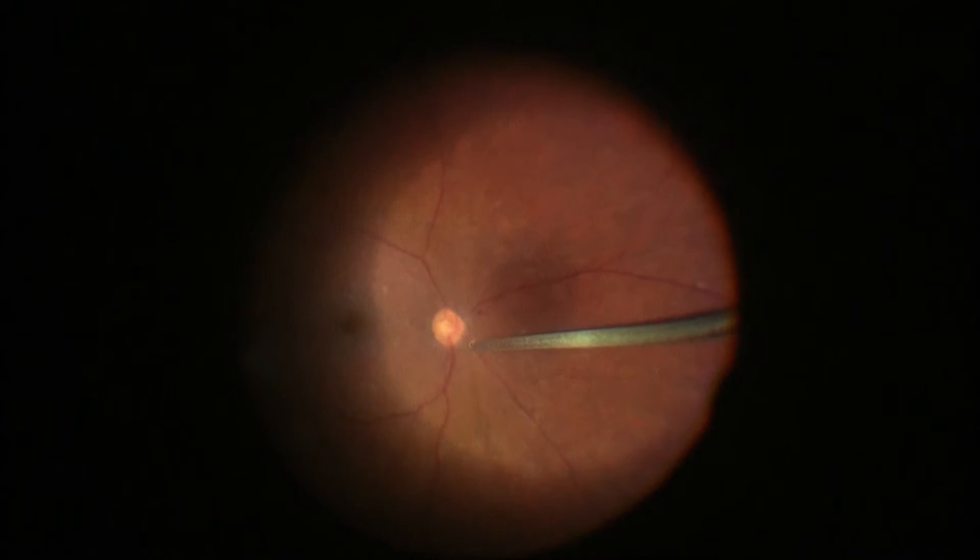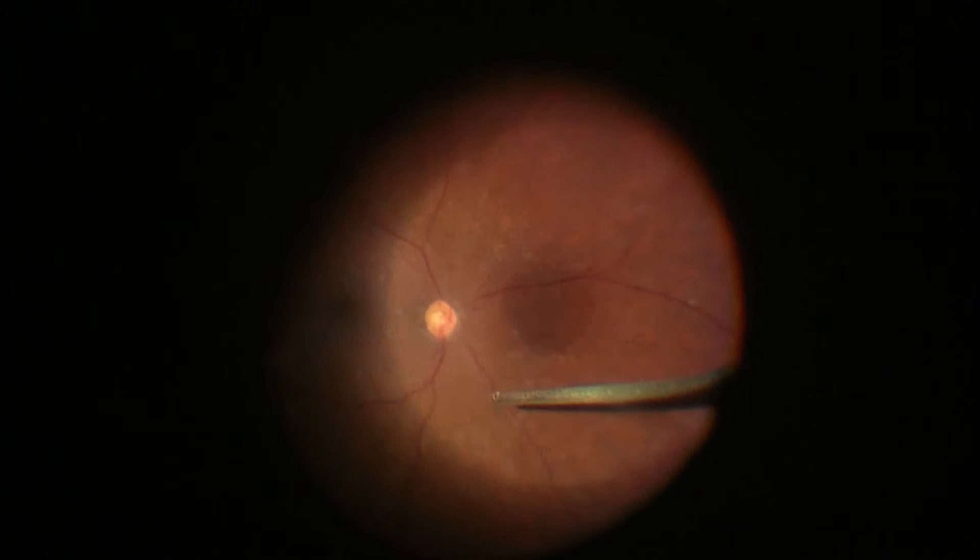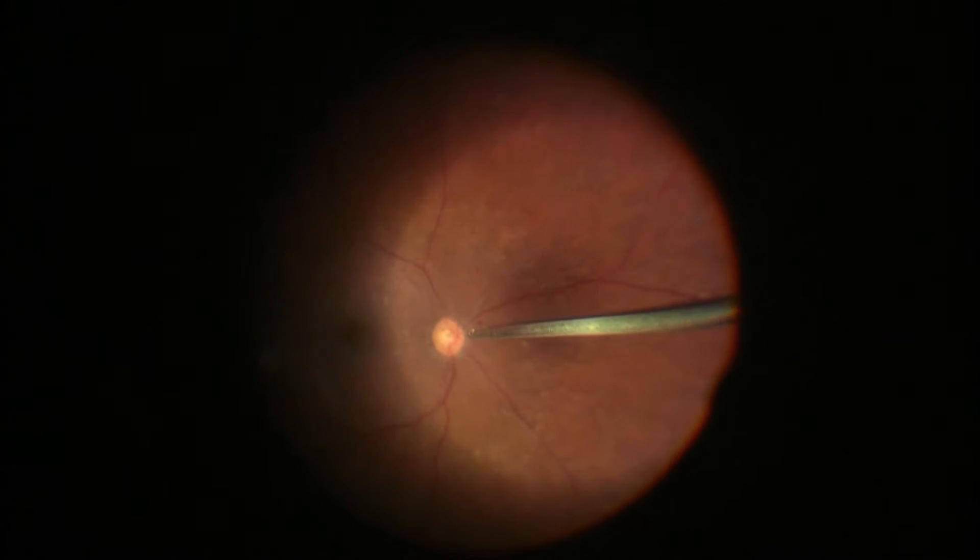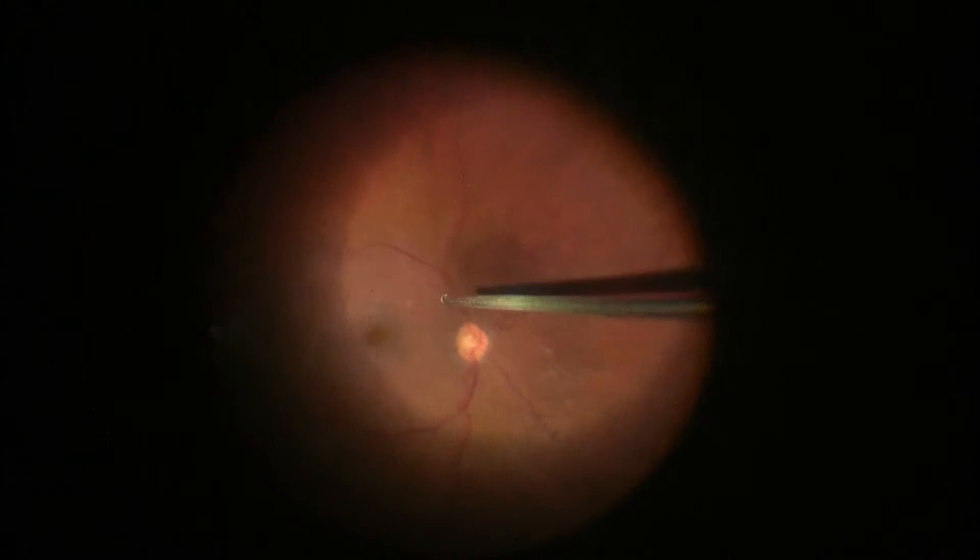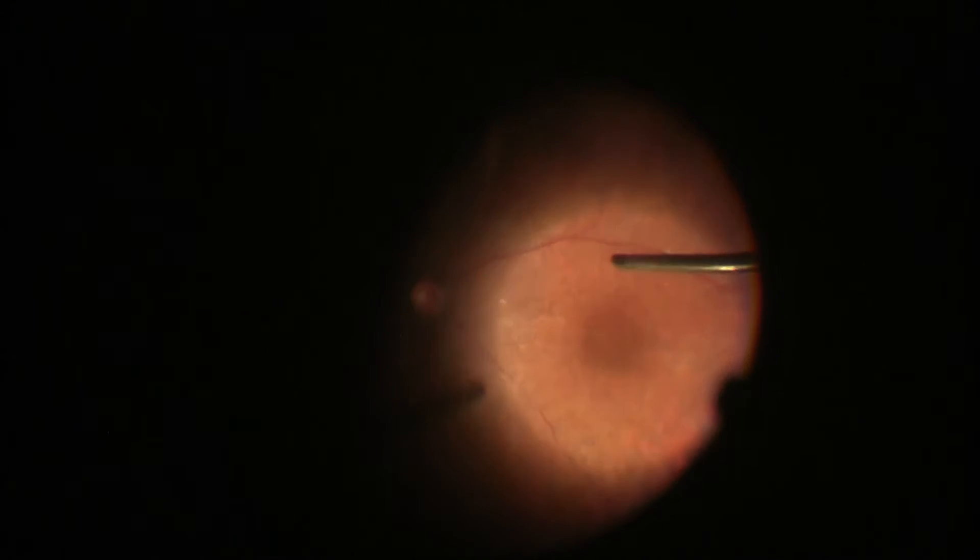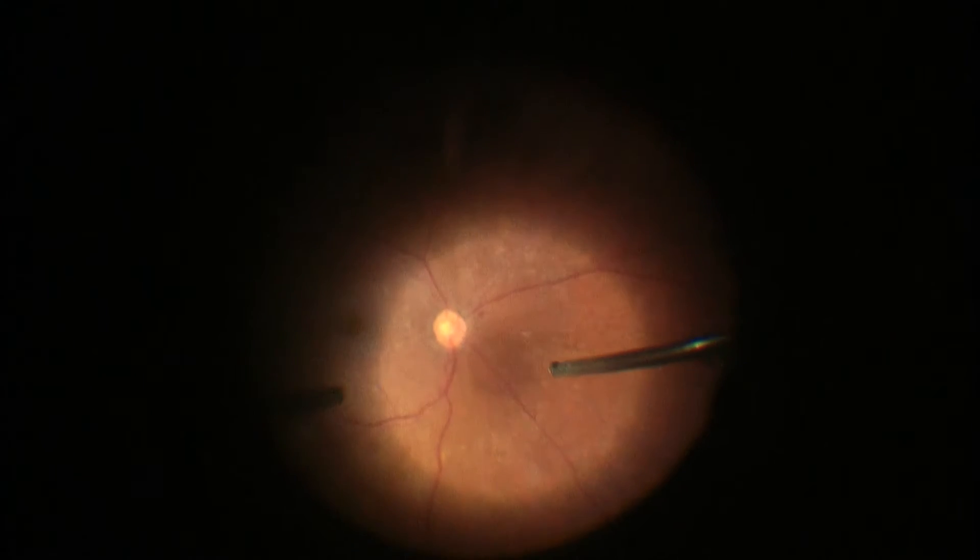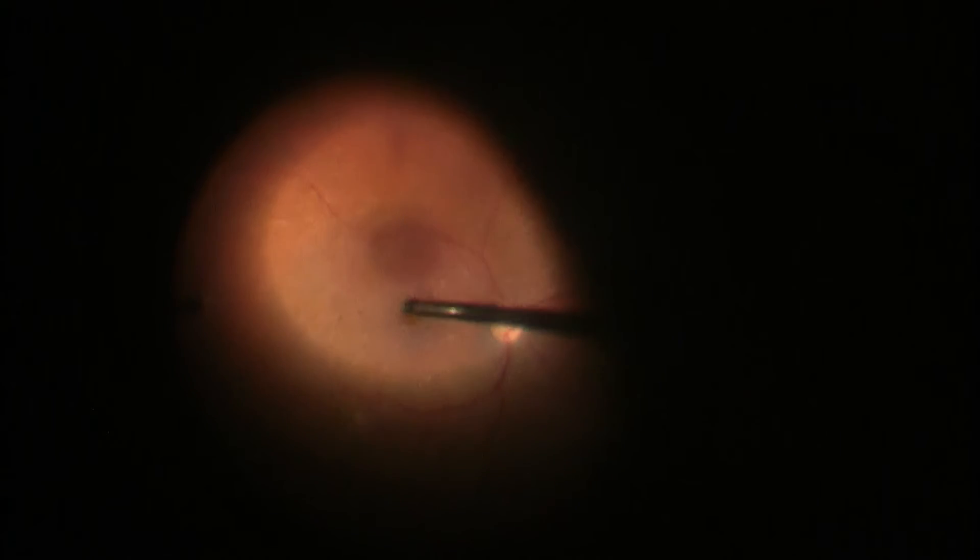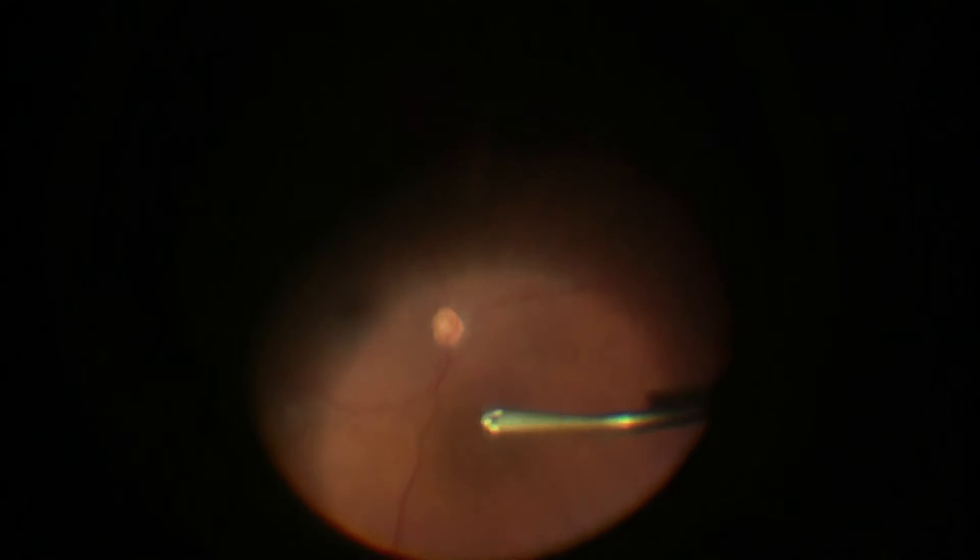Now that we've removed the vitreous, we're going to take a good look at the retina, the macula, the optic nerve. There's a little piece of vitreous still attached to the optic nerve, and we've just cut and removed that there. The retina otherwise looks pretty flat. You can't tell what a patient's visual prognosis is at the time of vitreous surgery, but you can have some idea, and you can tell that this patient has a good shot of doing well.